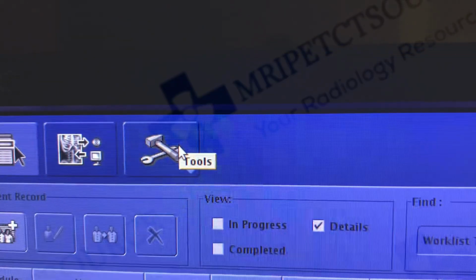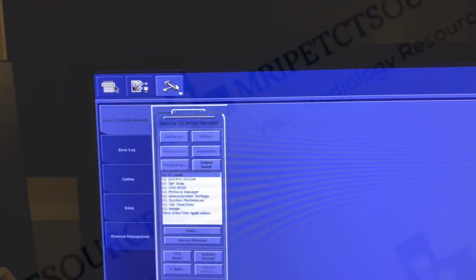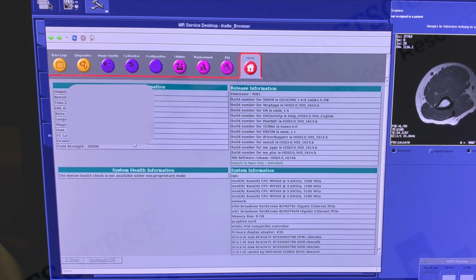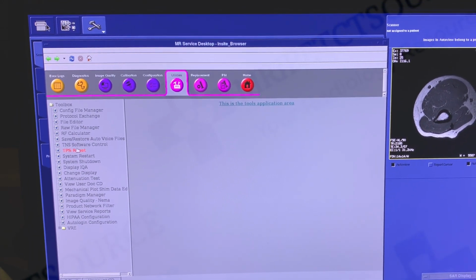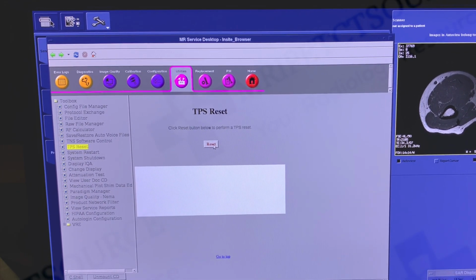The first step is to click on the service tools icon, which is located on the top left corner of your scan monitor. If this is the first time clicking on the service icon, a service browser will populate into the service browser home tab. Click on the utilities tab at the top of the service browser, and then click on TPS reset. Click the reset button to begin the TPS reset process.